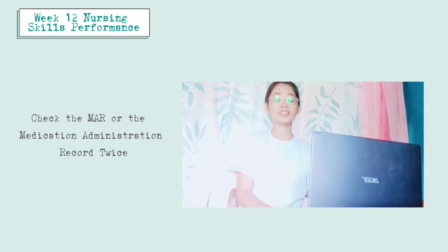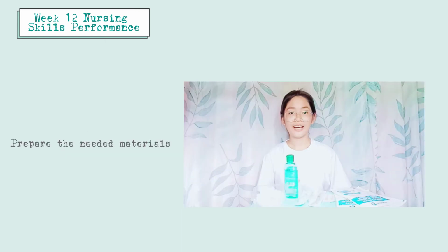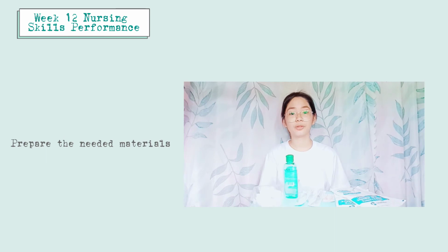Then, check the healthcare provider's order through the MAR. MAR means Medication Administration Record. So, check this twice. Also keep in mind the 5R, which are the right patient, right time, right dose, right drug, and the right route. After that, prepare the needed materials and equipment.